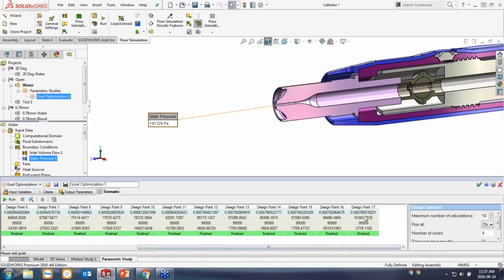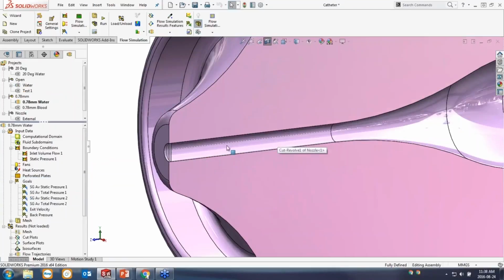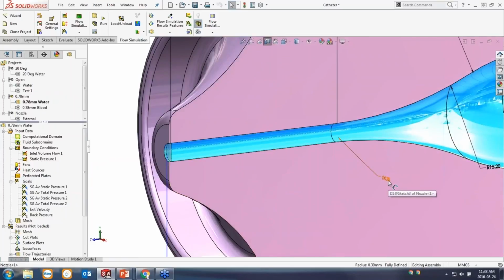And when I get to the end, I can see that it found I could get close to that 95,000. I gave it a tolerance of 5,000 pascals, so it got within that at 91,000 with a diameter of, sorry, 0.78 millimeters. And so now I know that's going to be the diameter that I want to use if I'm looking for that back pressure. And I can actually take this design point and create a new configuration and a new project based off of that, and I've got that over here, where I've set this nozzle diameter to 0.78 millimeters.